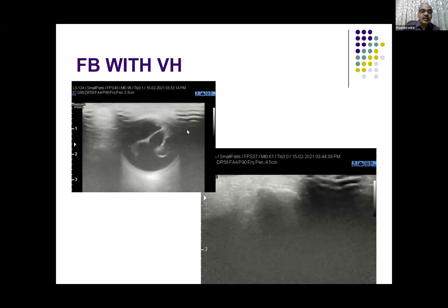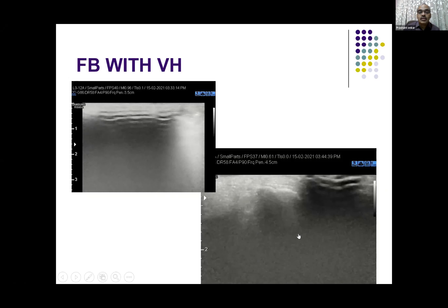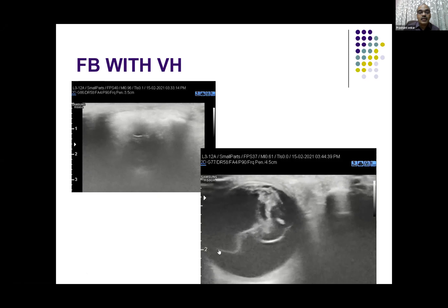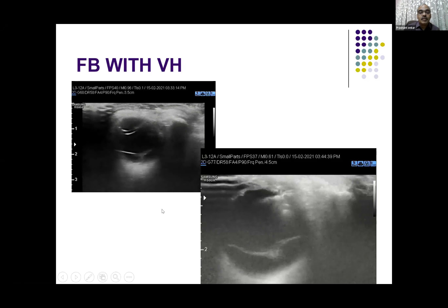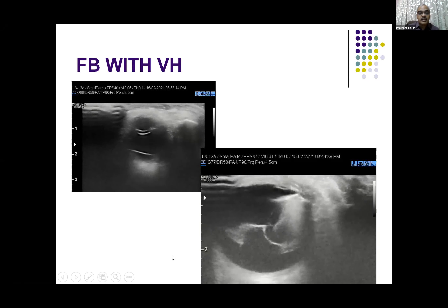This is another example. A very bright foreign body is seen — it shows reverberation artifacts and has produced separation of a membrane in the posterior vitreous. When the patient moves the eye, the membrane is freely mobile, indicating that it is a posterior vitreous detachment.